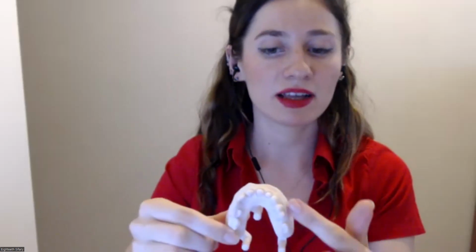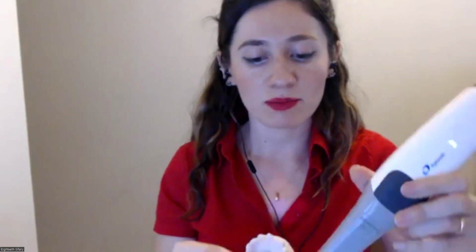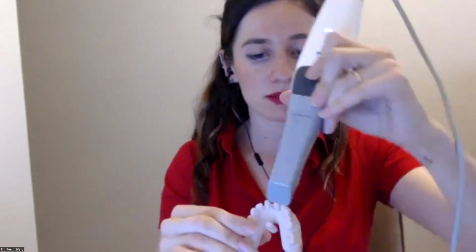After that, we are going to scan where the teeth are looking to the lip side, this area. I'm going to show you. So basically, it's very important. We are not going to scan all the teeth in a complicated way like this. No, we are not going to do that.